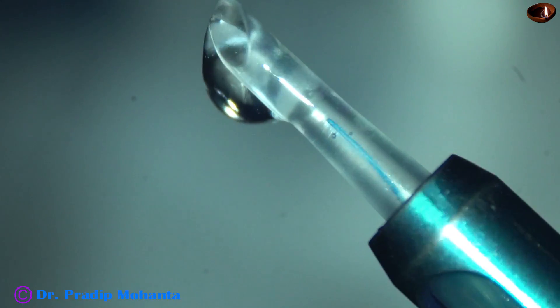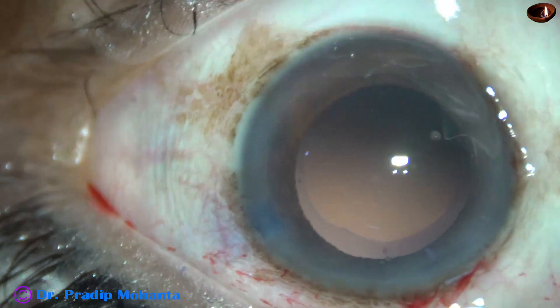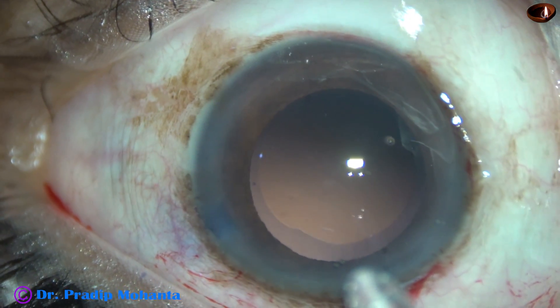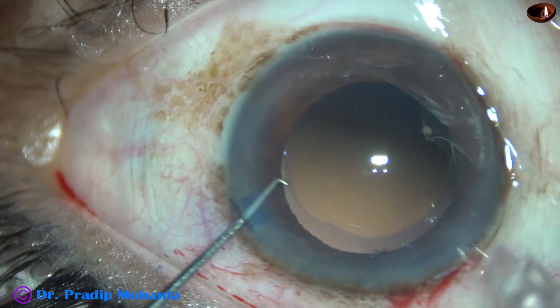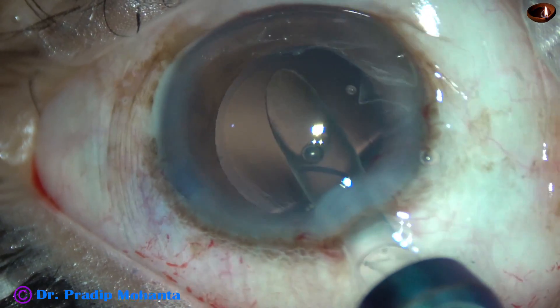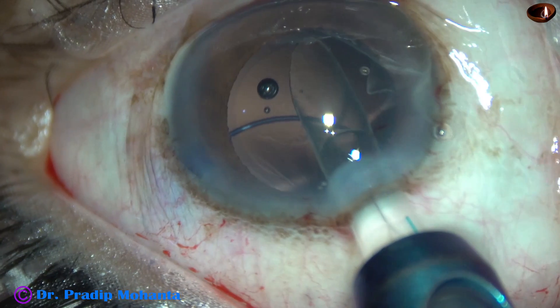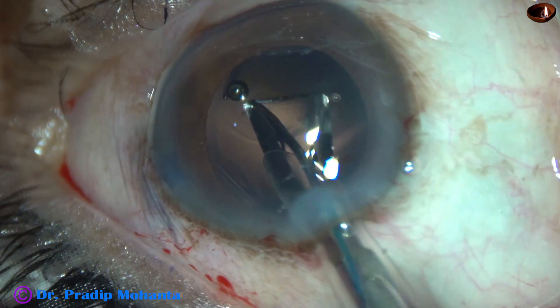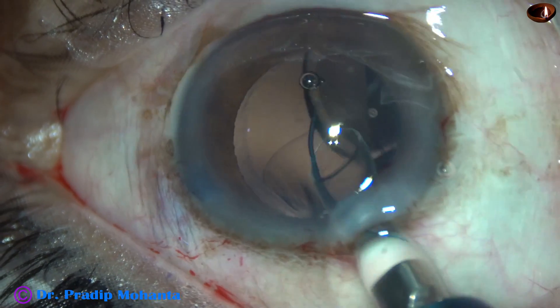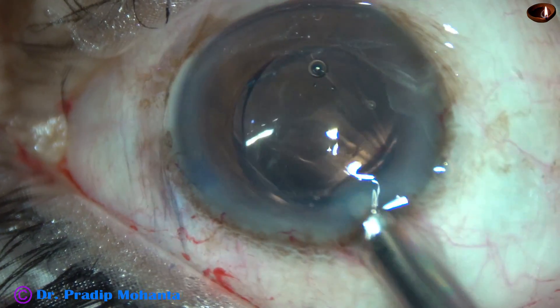We can see the leading haptic is near the exit point. The cartridge is introduced into the anterior chamber. With the help of the left hand, the shaft of the injector system is held, and the right hand screws out the lens. As the lens comes out, the cartridge rotates anti-clockwise. The piston is pulled back and again advanced to place the trailing haptic in the capsular bag.